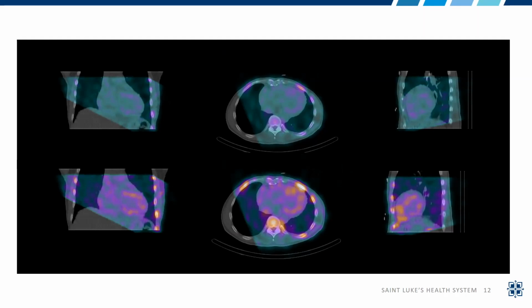Yeah, so on our studies, we acquire at 1 hour, and we take a look at those images. And if we have an image that is usually definitively positive, we will stop at that point. In some cases, and this might be a case where having a 3 hour image could potentially help, or you might think it would help. But we've seen that really the blood pool between the 1 hour and the 3 hour, there isn't a lot of difference.